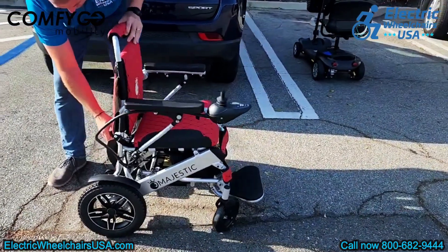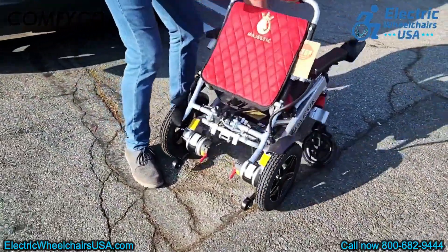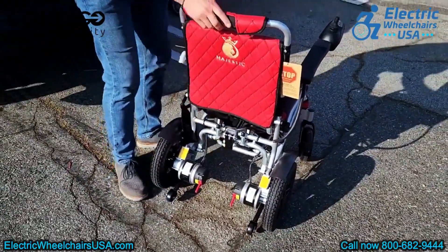You can reduce the speed when moving through crowds or in tight spaces like stores. Folding this power wheelchair is incredibly simple — just lift the black latch at the back, and the chair folds up in about 2 seconds. It also unfolds just as quickly.